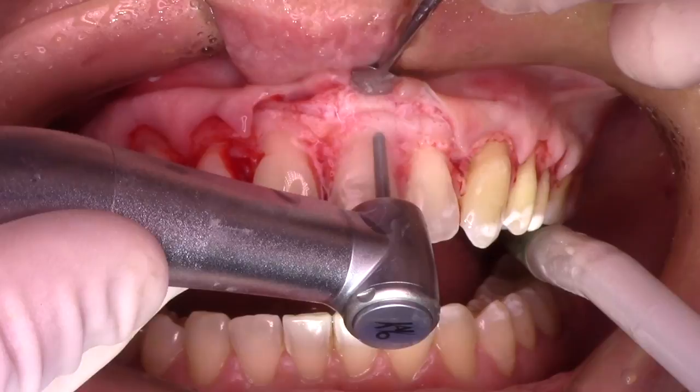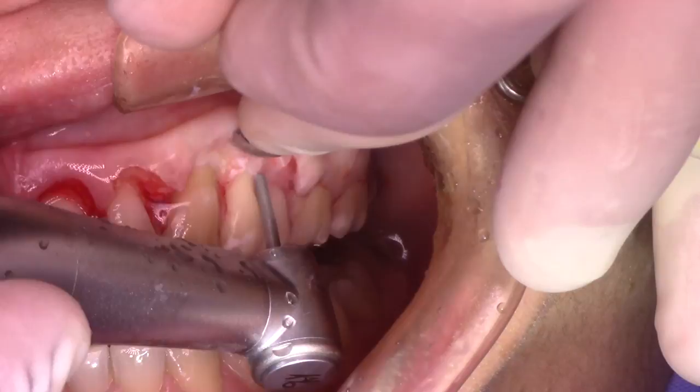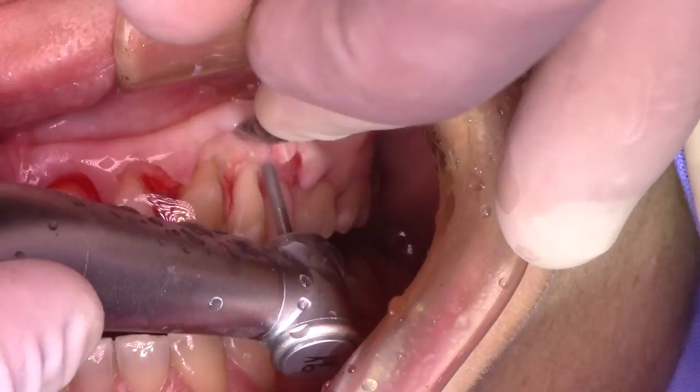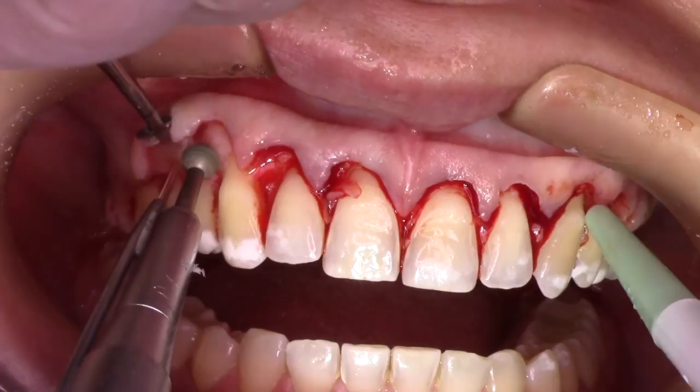After the second stage with the high-speed bur, you're going to have some sharp edges at the bone crest. So you can step back, get the large round bur again, and create a smoother surface and better anatomy, taking out the edges for a better fit and better contour of the bone in the buccal plate.